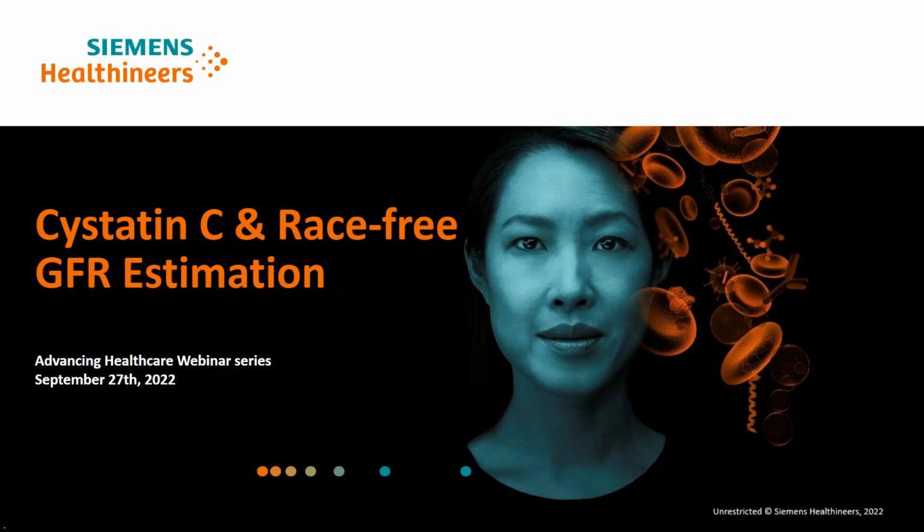That's a great question. I actually think we're underutilizing Cystatin C even based on outdated guidelines. For example, in the 2012 KDIGO guidelines, they do say Cystatin C should be used to confirm eGFR when the creatinine-based estimate is in question, or if you're at a cut point for diagnosing a patient, or you're at a border between different stages of CKD or between CKD or not CKD. It encourages Cystatin C as an alternative. And what we're seeing is it's very underutilized even based on those old guidelines.